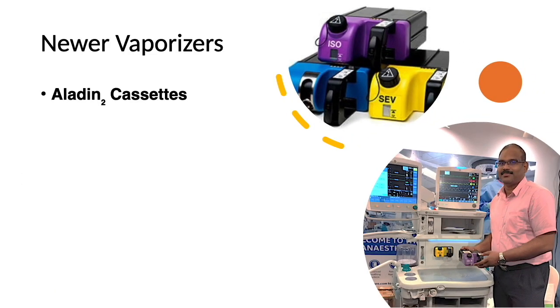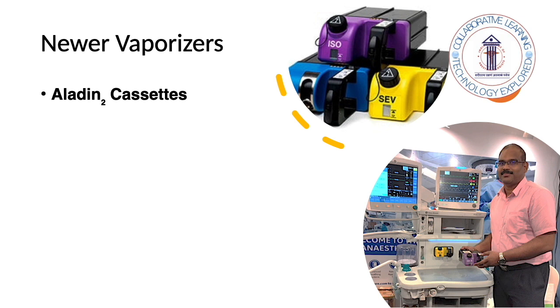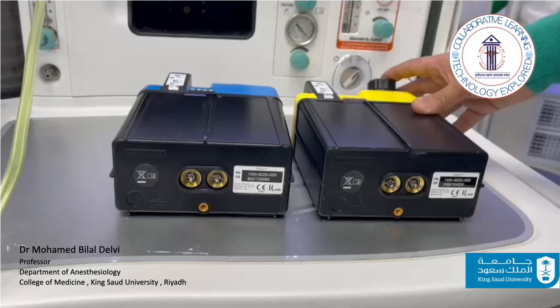Now let us focus on another key component, newer precision vaporizers. Yes, I know you are already thinking about the Aladdin cassette vaporizers. Dr. Mohammed Bilal has sent us this video from King Saud University, Riyadh. These are Aladdin 2 cassettes that contain the anesthetic liquid and serve as the detachable vaporizing chamber. The electronic vapor control unit is internalized within the anesthesia workstation.